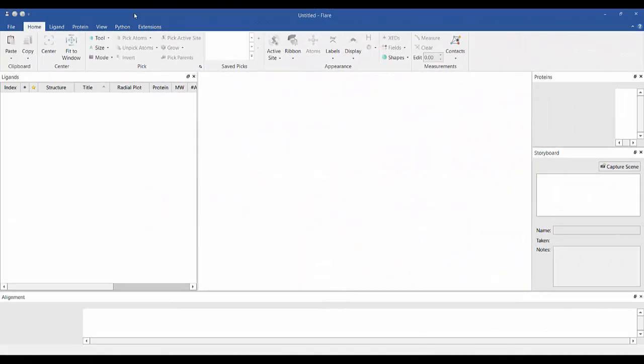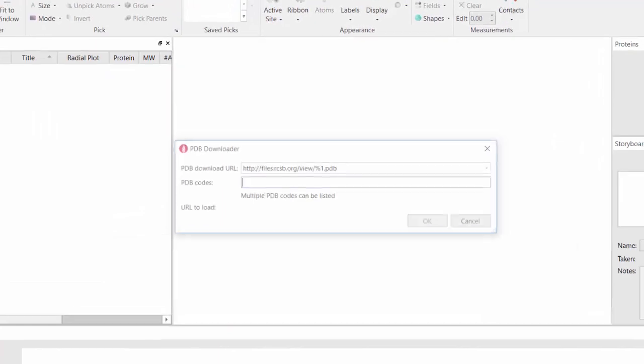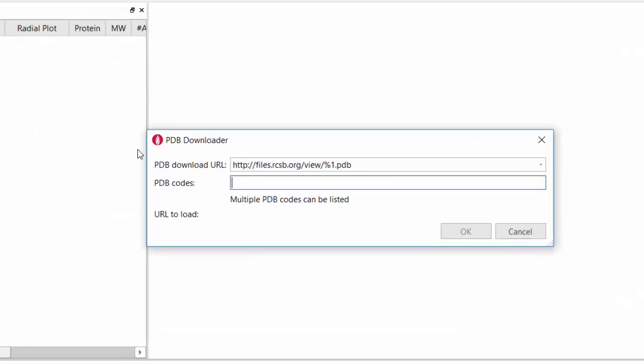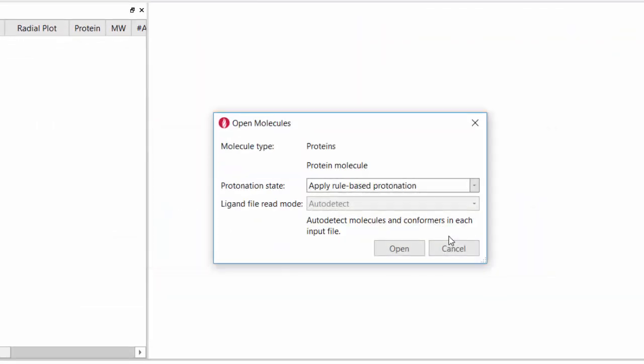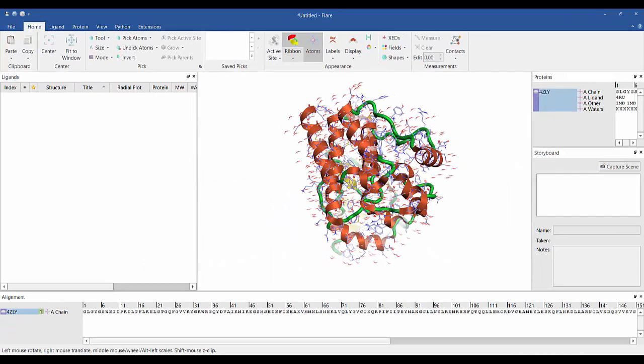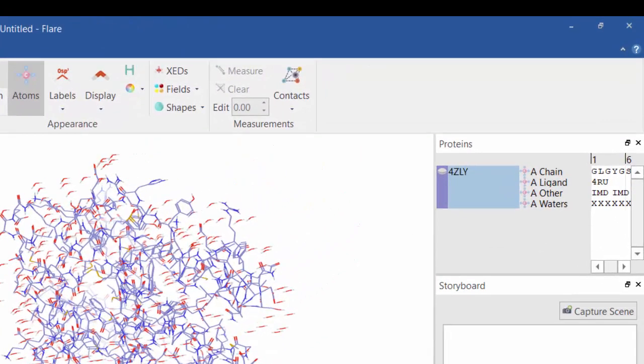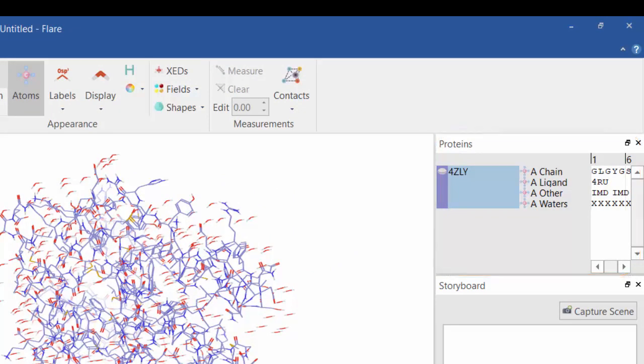Loading a protein-ligand complex is easy. Either browse to a file you have saved locally or download a file directly from the protein databank. The different parts of the protein—specifically chains, ligands, waters, and cofactors—are listed in the protein table.